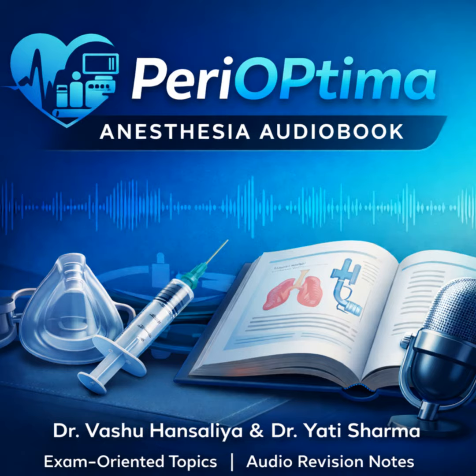This is Dr. Lichtenstein's legacy. Lung ultrasound. And it's all about interpreting artifacts. Since the lung is full of air, we shouldn't really be able to see it. But the air is in the image. The artifacts tell us the pathology. Okay, let's run through the key signs.